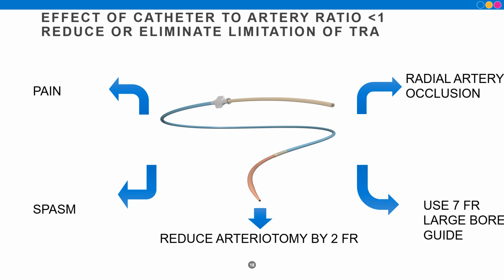Can we do that and hopefully eliminate or reduce the limitations of the radial approach and allow more patients to have a successful transradial approach?